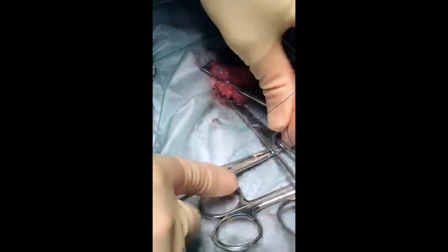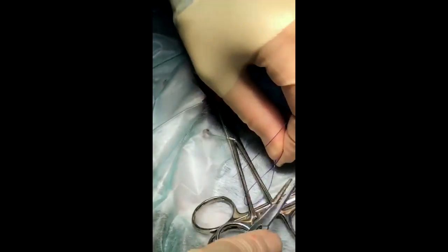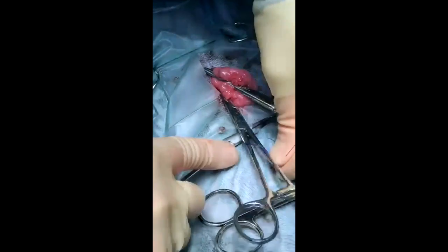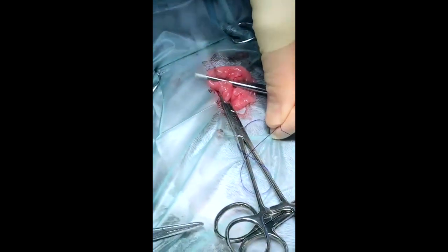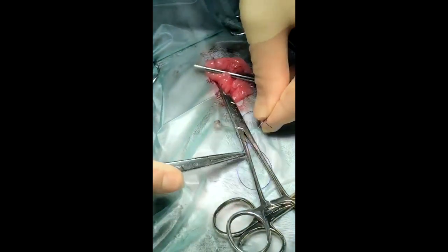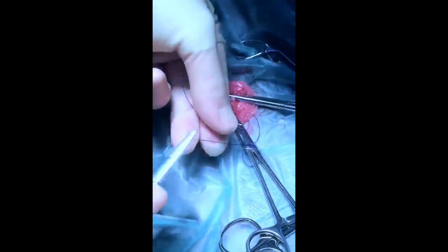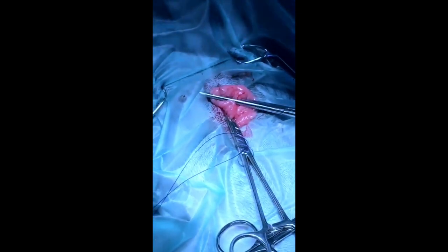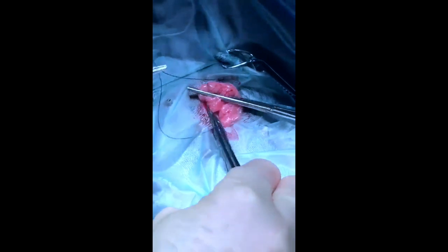I'm going to loosely pre-tie this loop of PDS with a constrictor knot ligature around this most proximal pair of forceps. Once formed, we'll lock the three ends with the mosquito forceps. You need a bit more space underneath these loops so I'm going to use the forceps just to free it up a little bit.